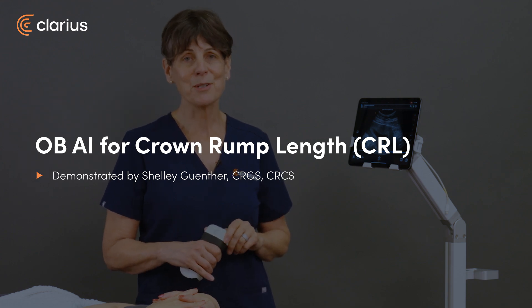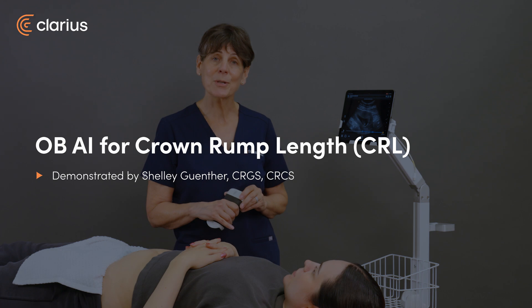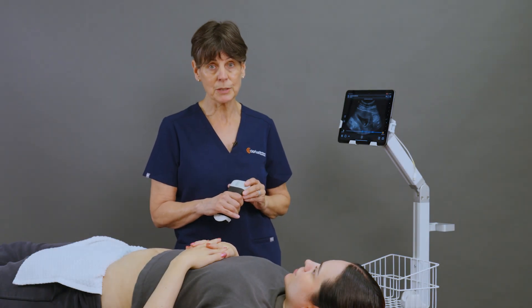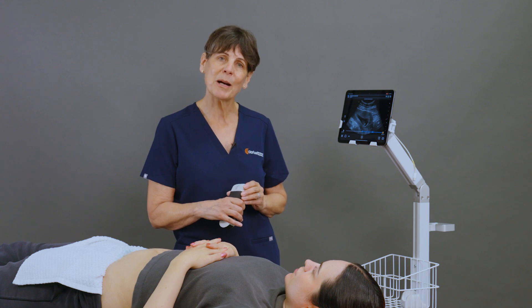Hi, I'm Shelley and today I'd like to introduce you to Clarius OB AI. We're on a mission to make fetal biometry measurements easily achievable to caregivers regardless of their level of ultrasound training. So let me show you how it works.